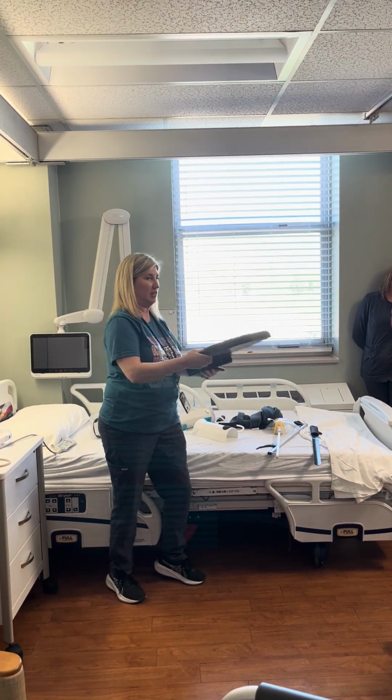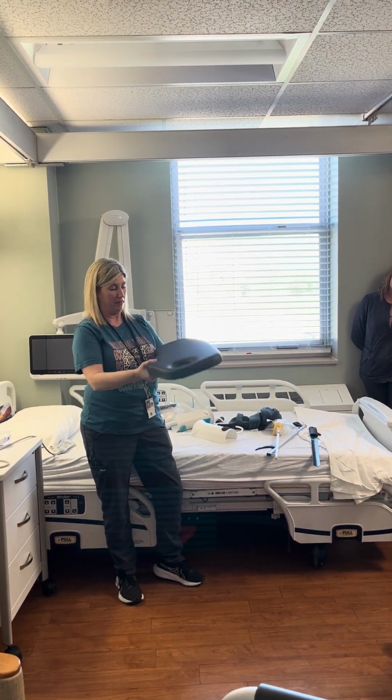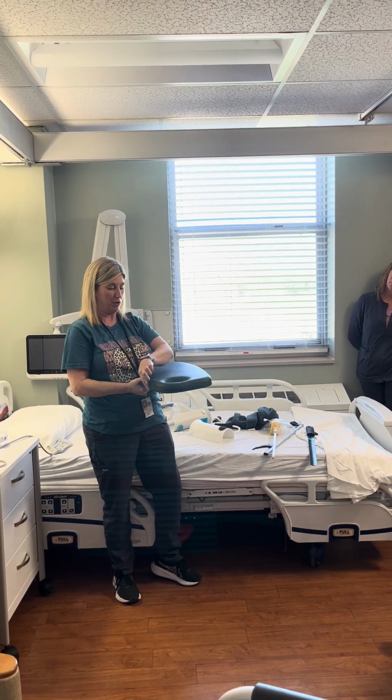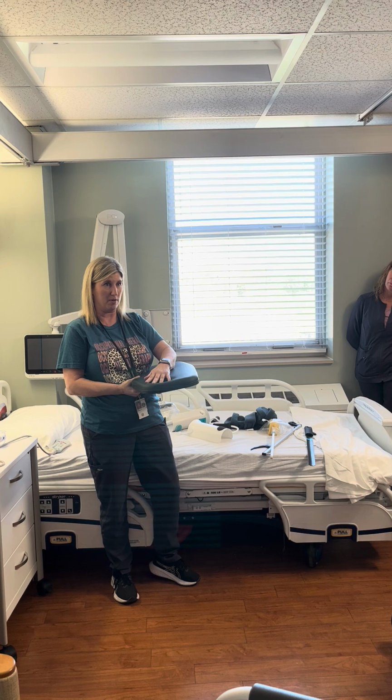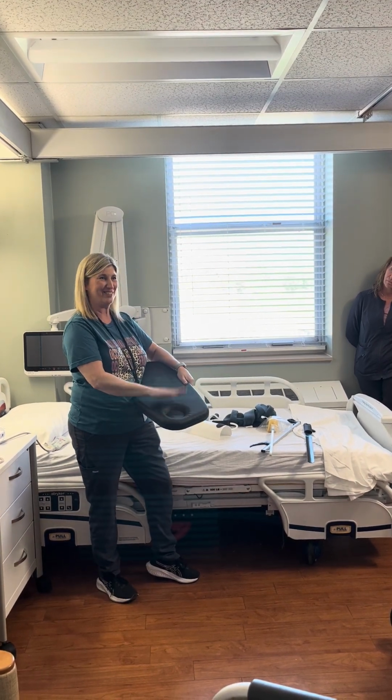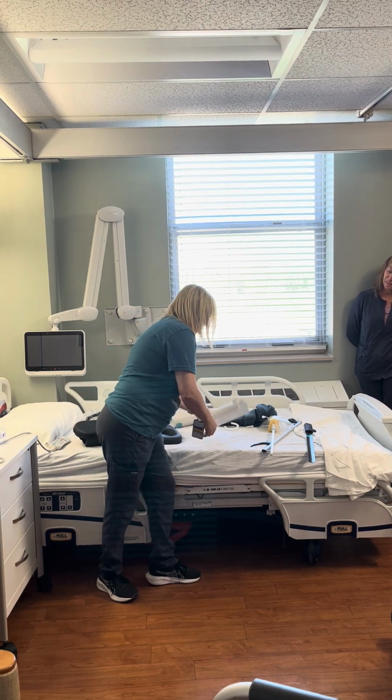So we want to give them this lap tray that's like a desk. And then that just slides on and their arm can hold. Sometimes we'll put a piece of Velcro across it just to hold their forearm on top of there. We do not use the cup holder. The cups will not stay on there, so don't do that.